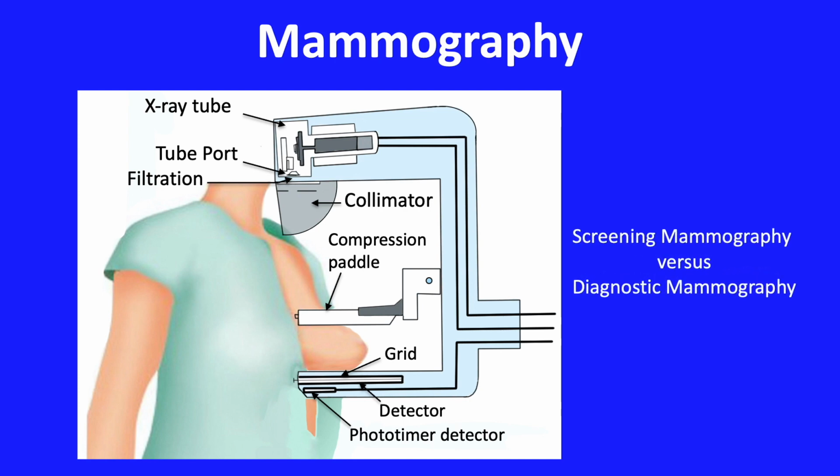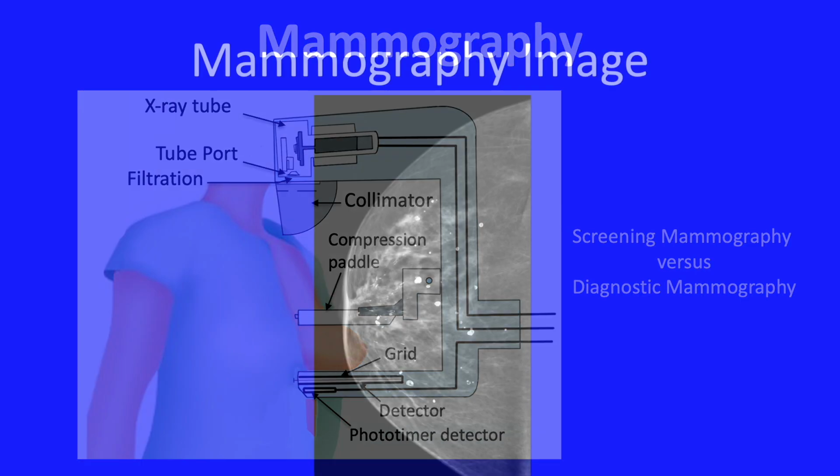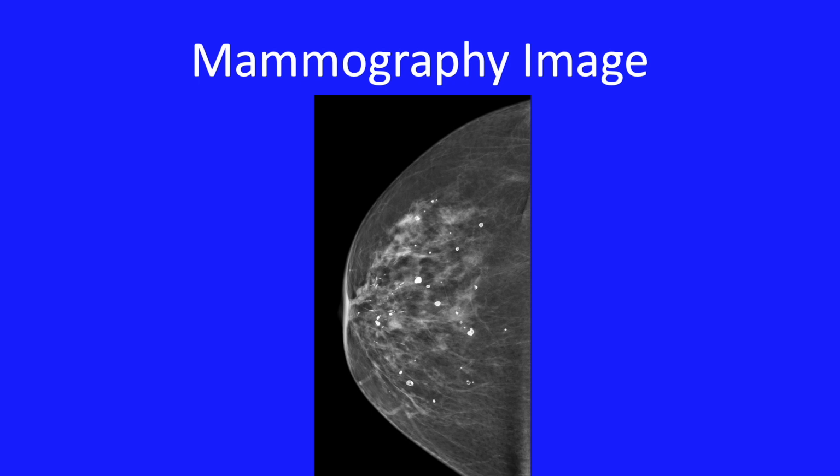Screening mammography is done on asymptomatic women with a normal physical exam in order to detect cancer early enough to improve patient outcome after the diagnosis, ideally a cure. In contrast, diagnostic mammography is done to characterize the nature of clinically suspicious signs and/or symptoms of breast cancer. In a typical mammogram, the breast and a limited portion of the axilla and pectoral muscles are within the field of view. In addition, contrast resolution provided on mammography images is limited, with few radiographic densities appreciable for diagnosis.